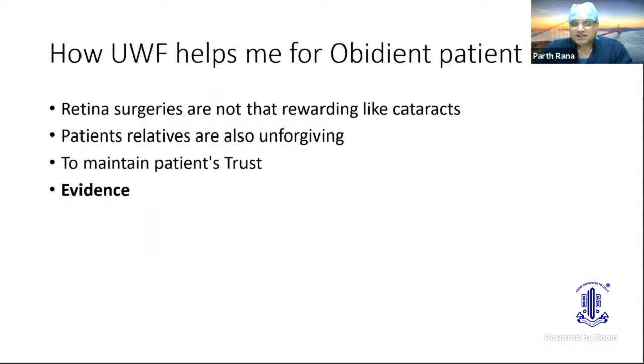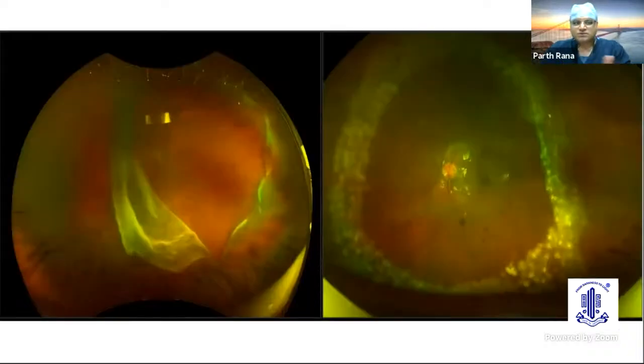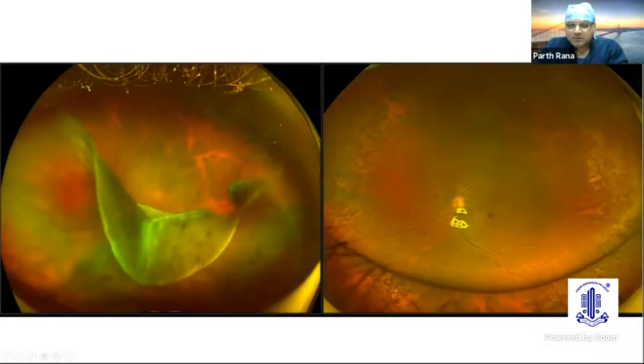So to maintain patient trust, we need some good evidence in our hand of what has happened and what we did. This is one of my patients who was having a giant retinal tear. Before surgery, I showed the patient, your retina has fallen totally like this. It has torn apart. And on the next day of the surgery, as you can see, this picture is from the next day. Despite the silicone oil and so much corneal edema, I was able to take the picture and show that your retina is on. Right now you are not able to see totally, your vision is a little bit less, but your retina is on. So my part is almost done. In many cases we are able to help the patient like that.